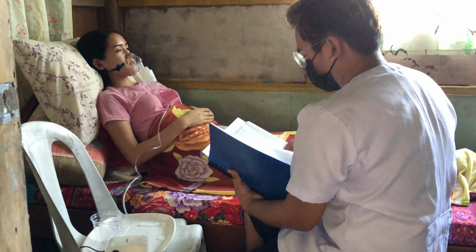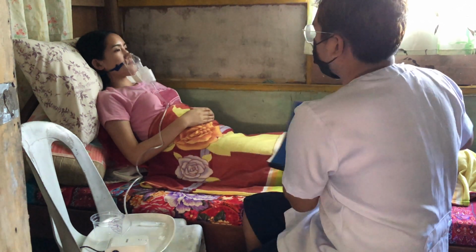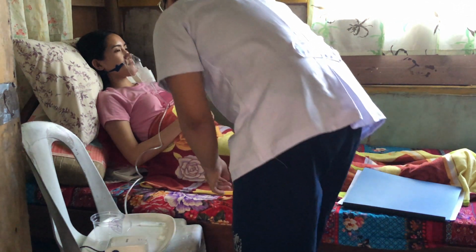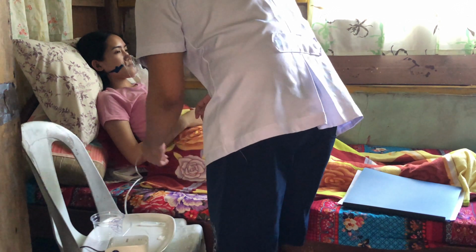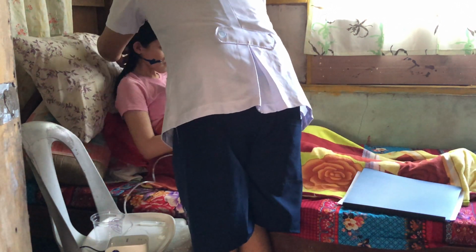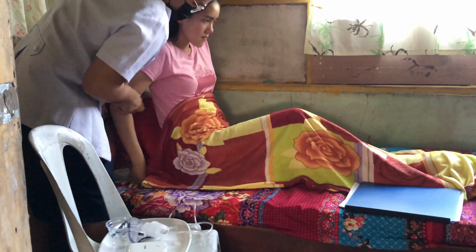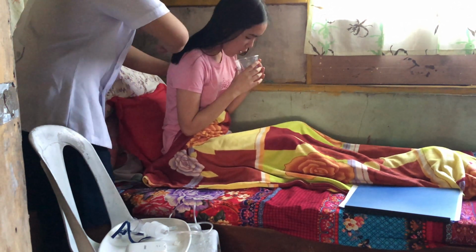Remain with the patient until all the solution has been nebulized. Instruct the client to continue the treatment until he or she can no longer see a mist on exhalation from the opposite end of the mouthpiece or vent holes in the mask. Lack of mist ensures that the client has inhaled the entire dose. Encourage the patient to expectorate, as the medication may help to loosen the bronchial secretions.